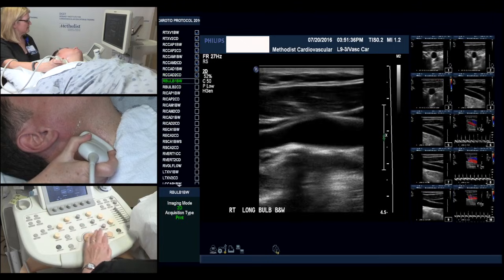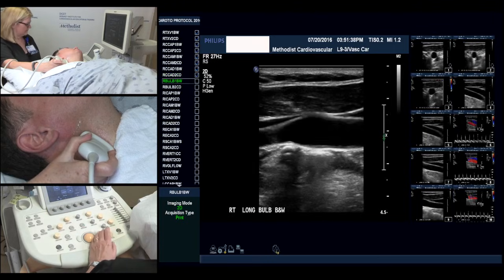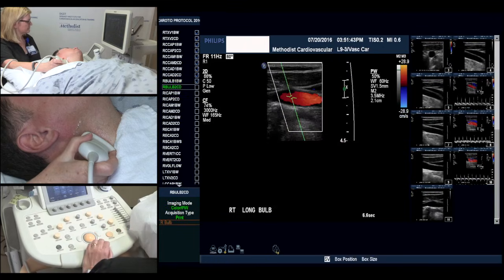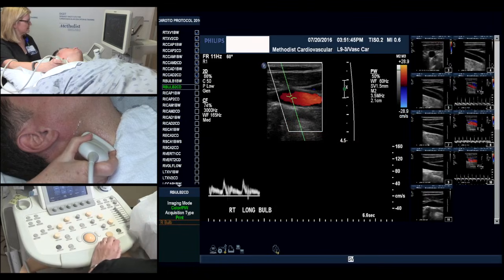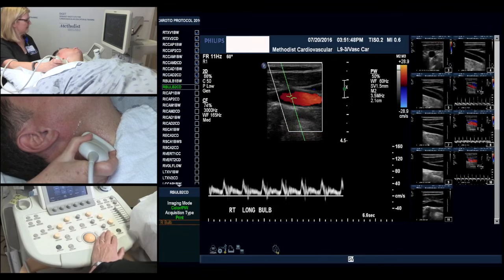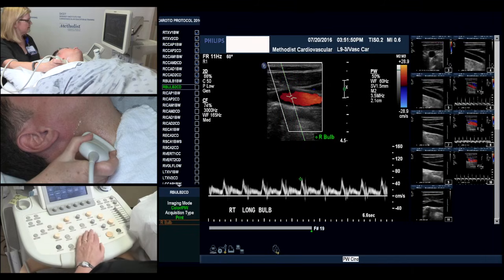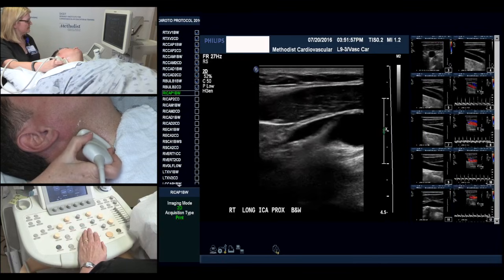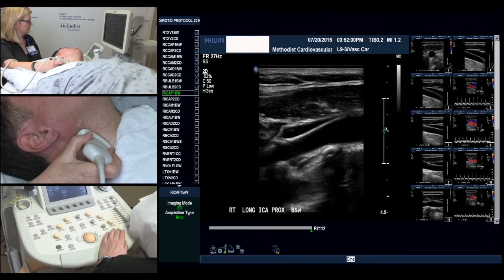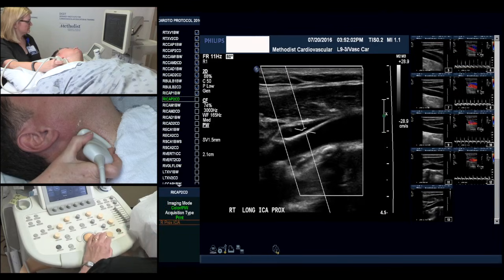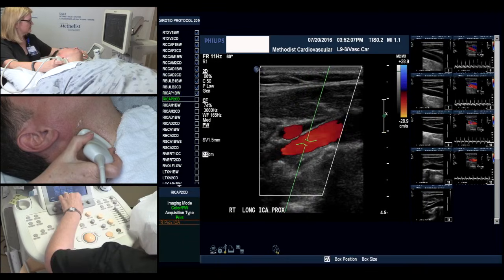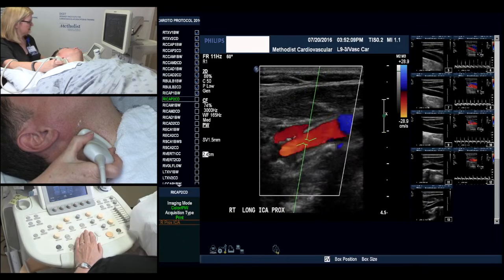We'll now look at the bulb. We obtain Doppler signals if there's pathology here. In this case we do not have any, but we'll go ahead and demonstrate. And then we move into our internal carotid artery, and again, sampling our Doppler, maintaining a 60 degree angle.